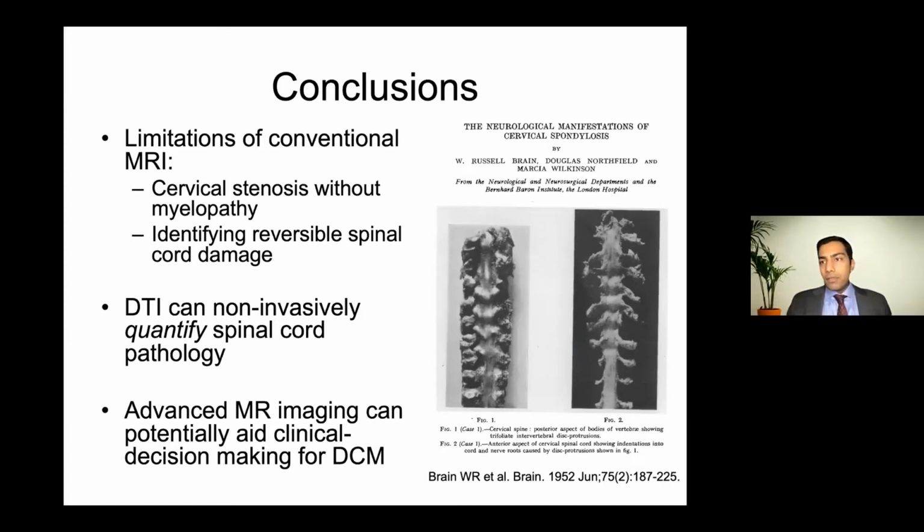DTI is non-invasive, and I think it's ideally suited for spinal cord where it's not feasible to get tissue for analysis. And I think the use of DTI in a smart way can potentially aid clinical decision-making in these patients.